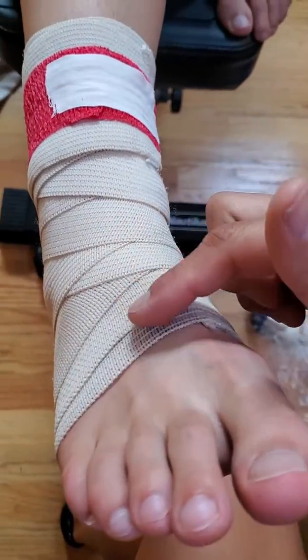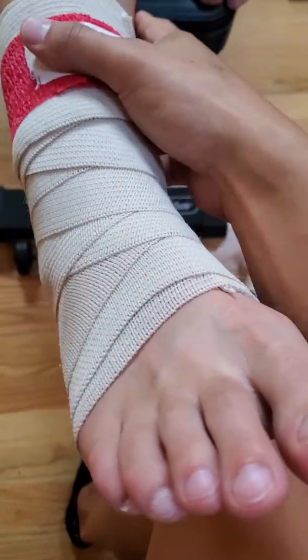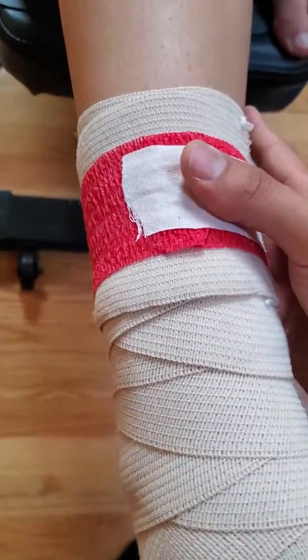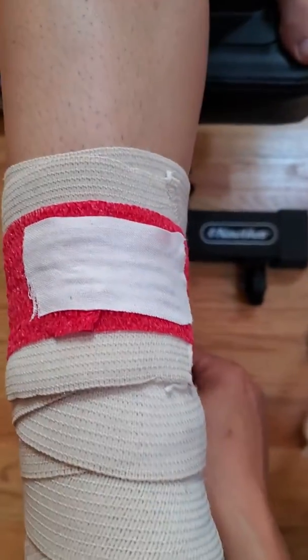So the final product is the X pattern going up, still pretty loose to allow for swelling to take place, and red elastic tape covered by inch and a half tape.